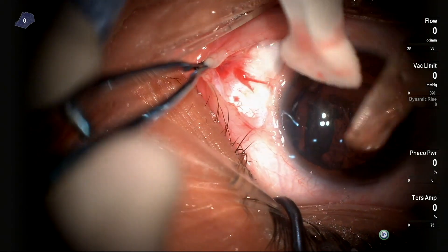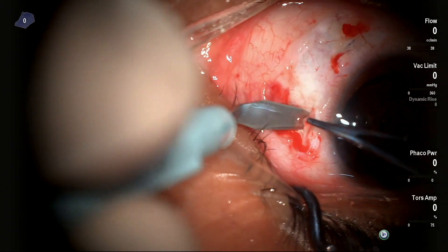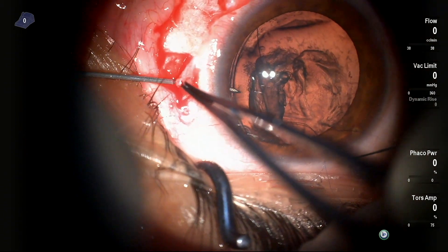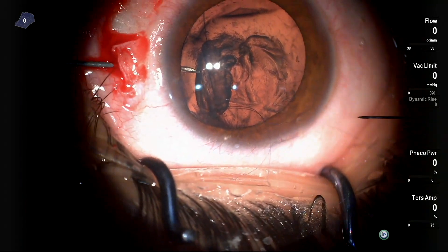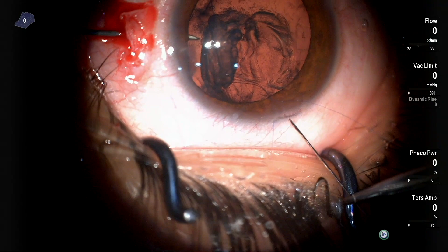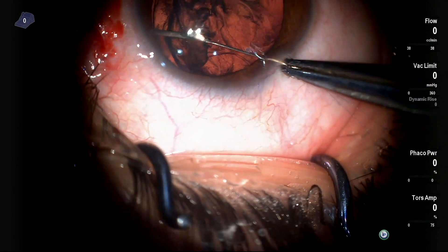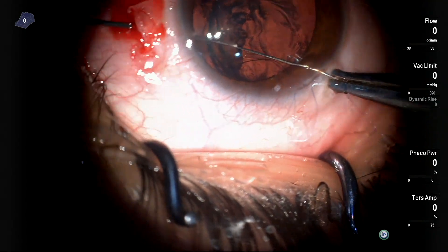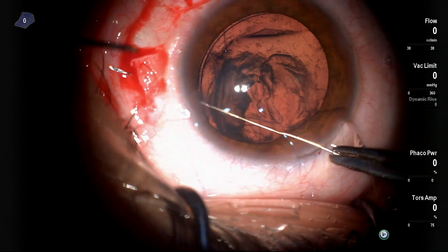I found that this CTR–capsular bag complex needs nasal support as well. So I did the same technique with the proximal thread, which passed through the proximal eyelet of the CTR. The first needle was externalized using the same handshake technique.